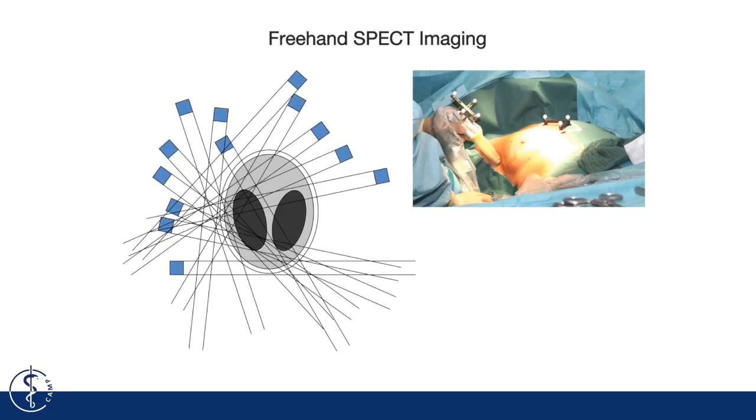In the end, accurately calibrated gamma probe and tracking system measurements are combined. While such a set of measurements may look very different from the one a standard SPECT scanner would produce, the reconstruction into a 3D volume follows the same mathematical principles. But we can even do better than this.